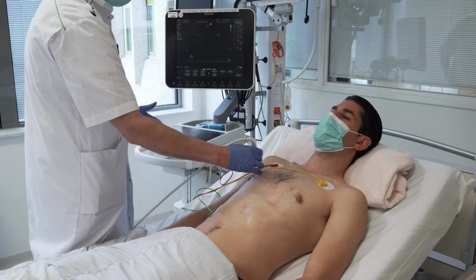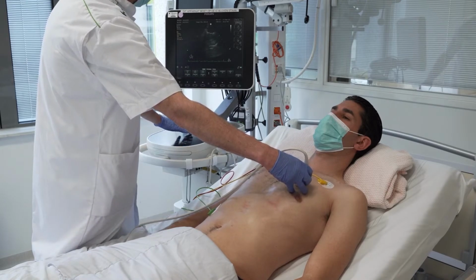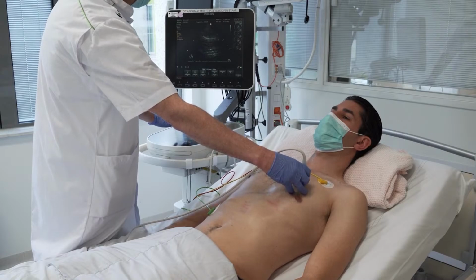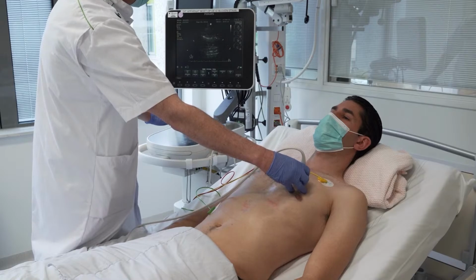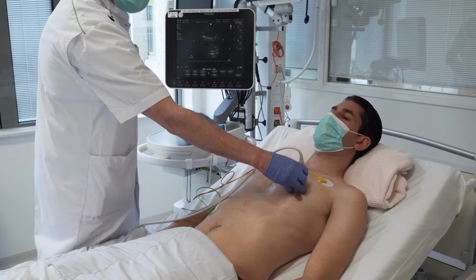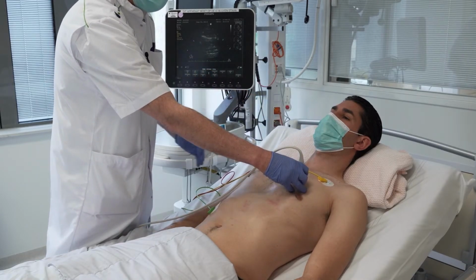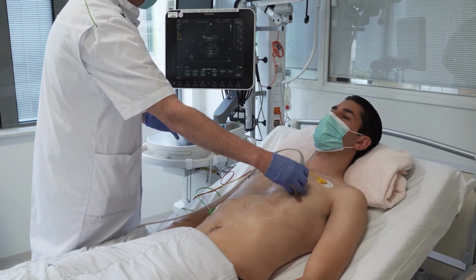We can also do this on the left side. Of course, you also have your clinic, so you will have a clinical suspicion of a pneumothorax, or even a tension pneumothorax with asymmetric thoracic excursions and a high CVP and patient in obvious distress, etc.